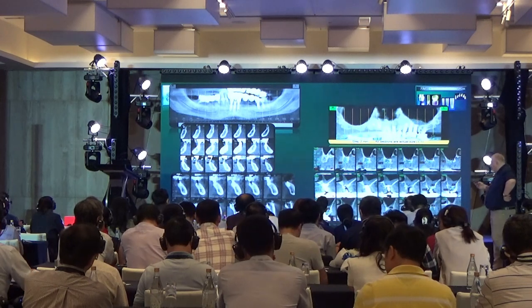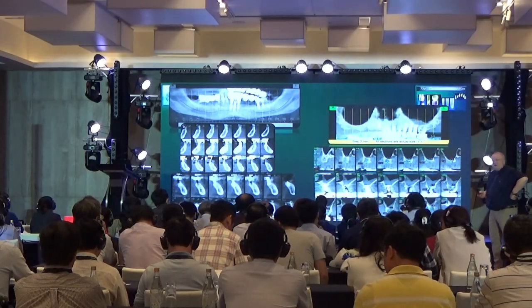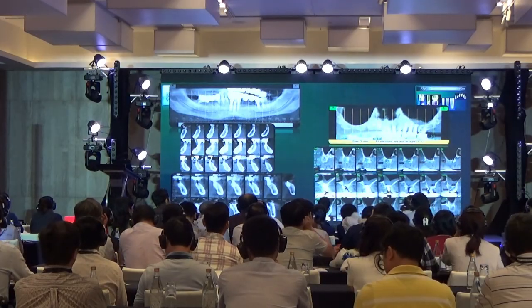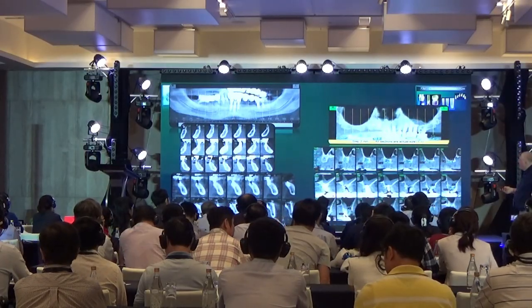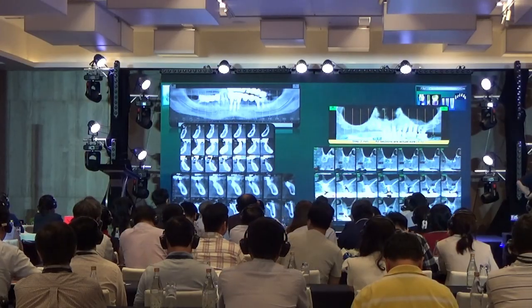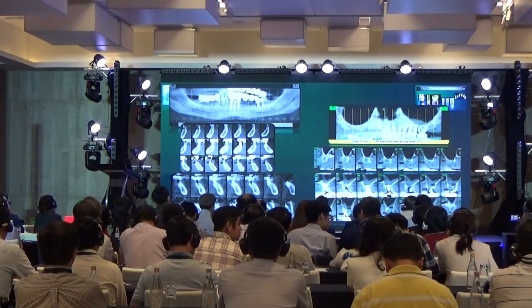But if you look carefully, you can see that those 3 implants are okay. So one of the problems is if you try to remove them, you're going to lose a lot of bone. So you need to decide whether you're going to remove those implants or not, or what else you are going to do with them. And you need to decide what would be the temporary in this case.